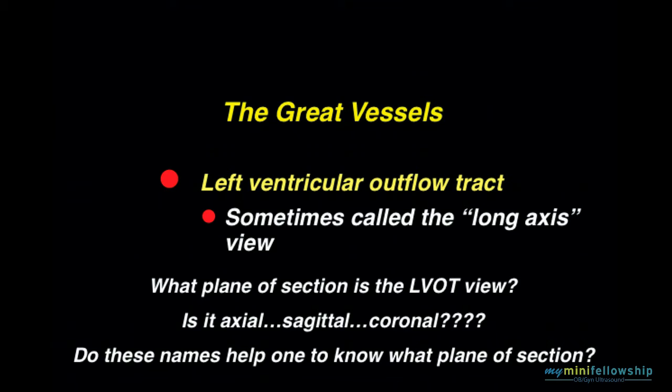When the answer to that question is no, unfortunately, that begets the "twist your hand around until the picture looks like it does in the book" approach. Again, I want to assure you, if that is your planned approach, you will fail. You simply cannot do it with that approach.